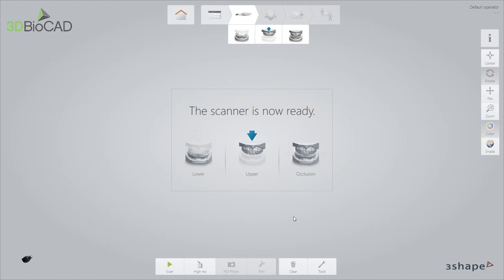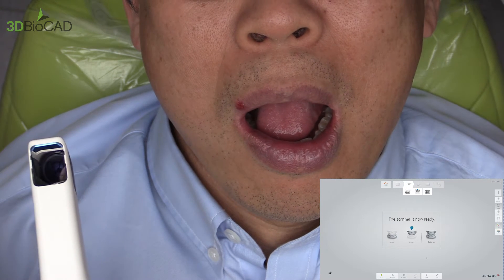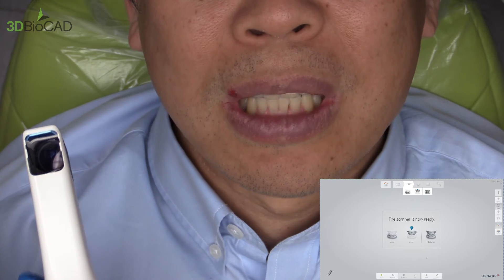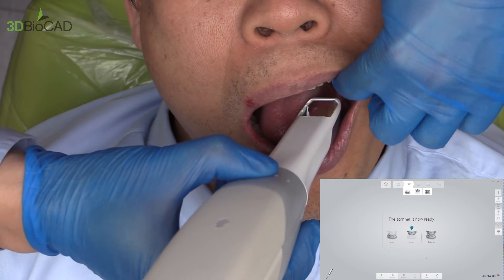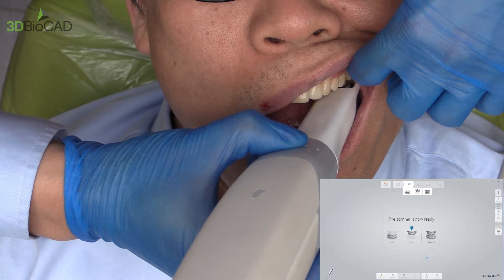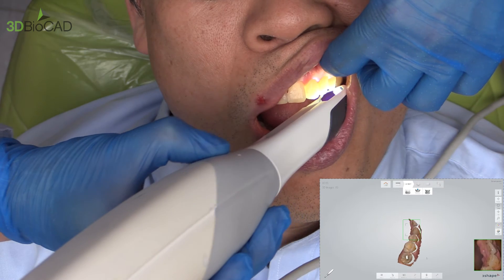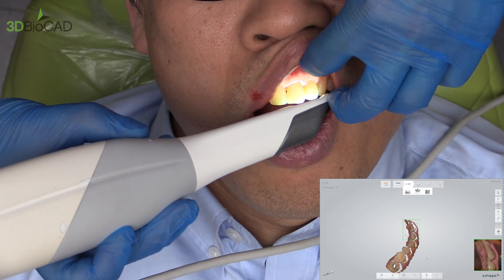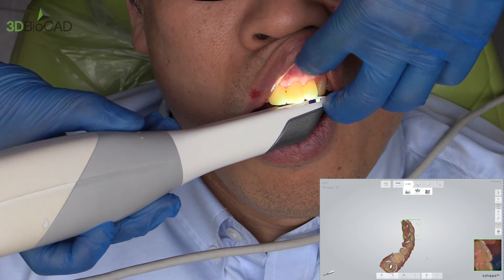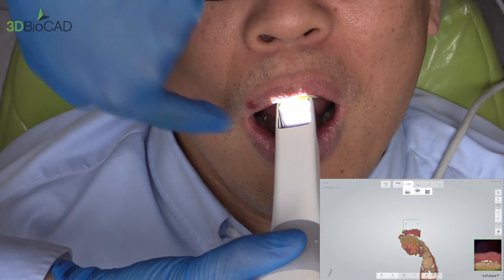I'll start the scan from the upper first because the upper is easier to scan. I tell the patient to dry themselves, and always make sure the patient is relaxed — if they relax, I can retract the lips more. Starting from the occlusal side, just follow the curve and make sure you drop your scanner. If you pull out the scanner too much, you'll be capturing the lip.